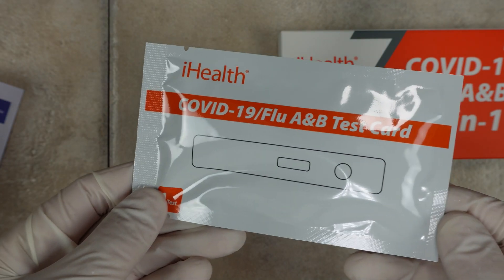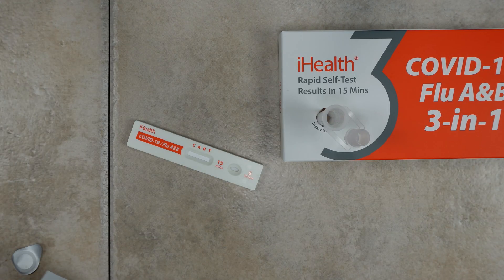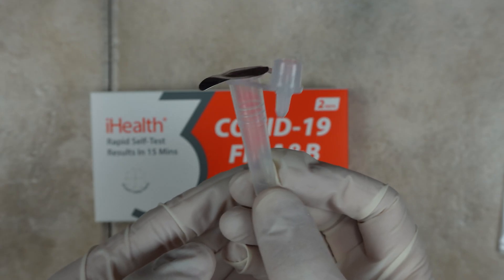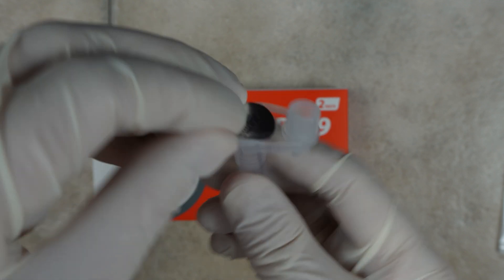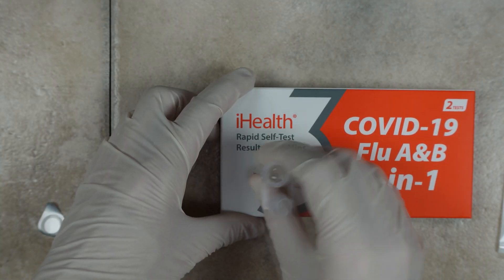Open up one of the white packets that contains the test card and just set it aside for now. Grab one of the tubes and peel the foil off the top of it, then press it down into the perforated area of the box.